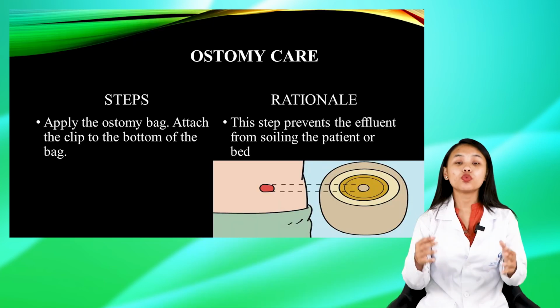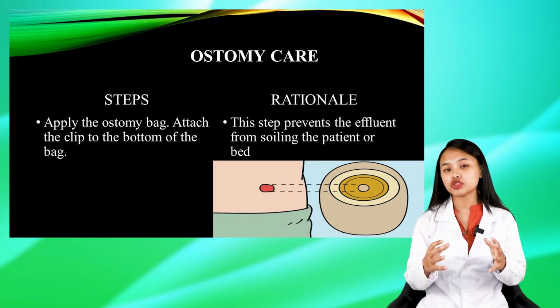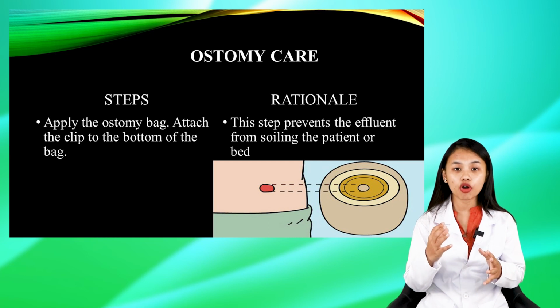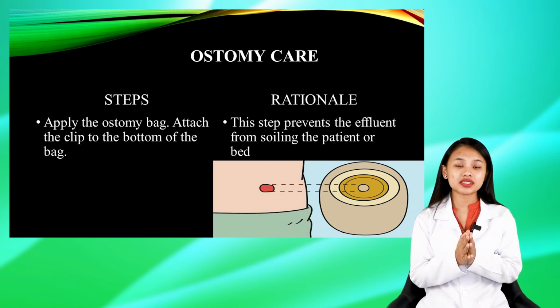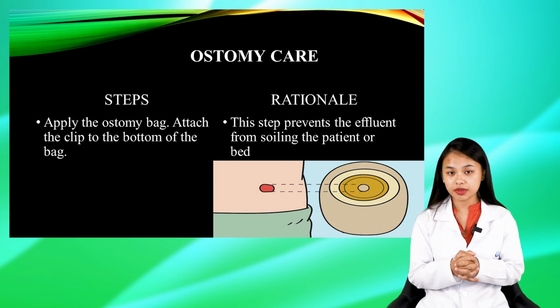So once these steps have been done, we can apply the ostomy bag and we can also clip it to the bottom.